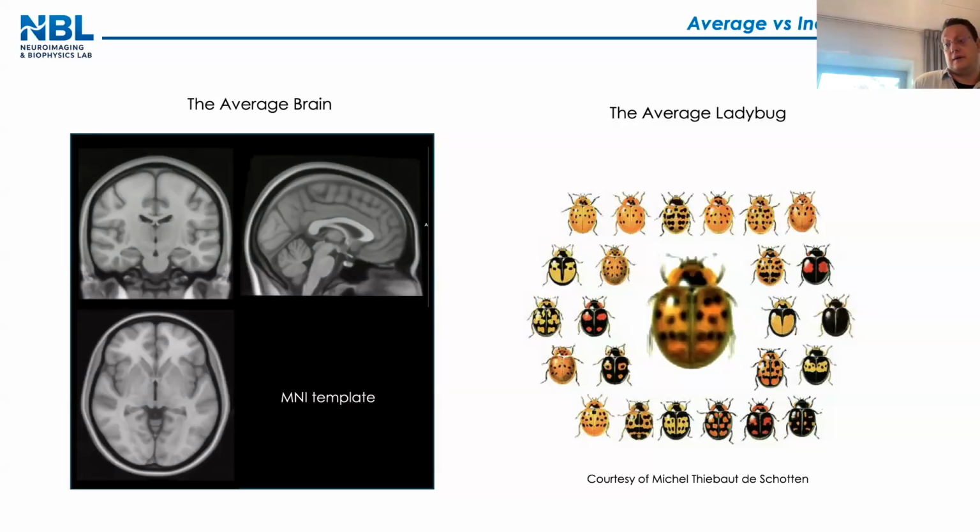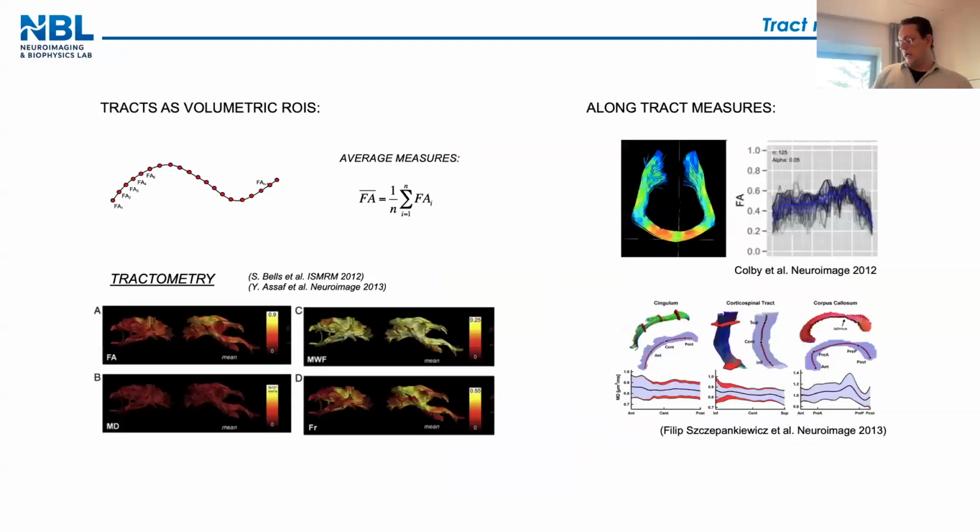And so in tractography, because of that, we can have a big track or small track, or big volume or small volume, just because the anatomy varies across subjects. And when you do that, then you can quantify the mean FA on the track, or the mean myelin fraction. The moment we have any MRI maps you want in the space of the tractography data set, you can sample it and get a mean FA along the track.